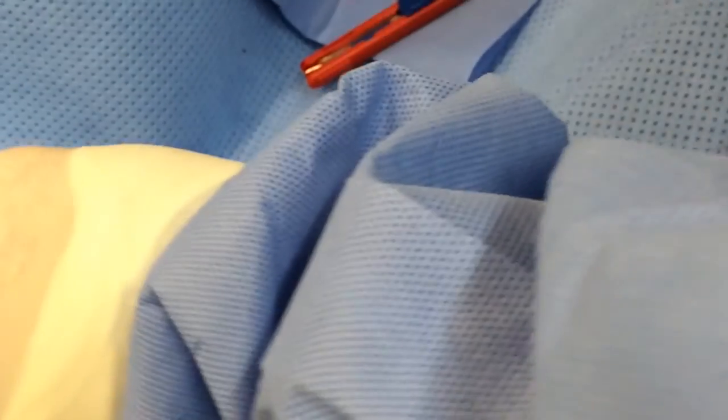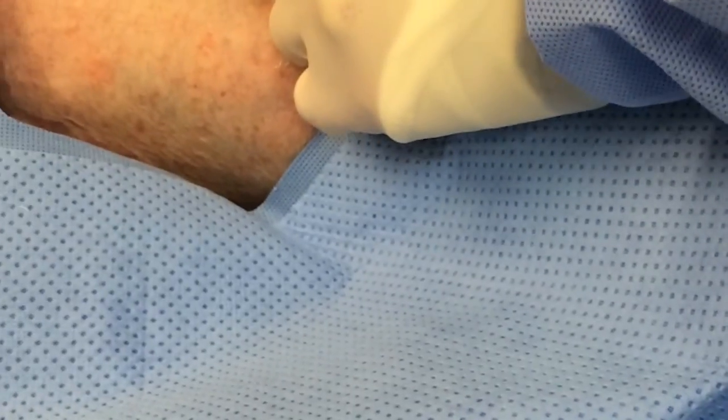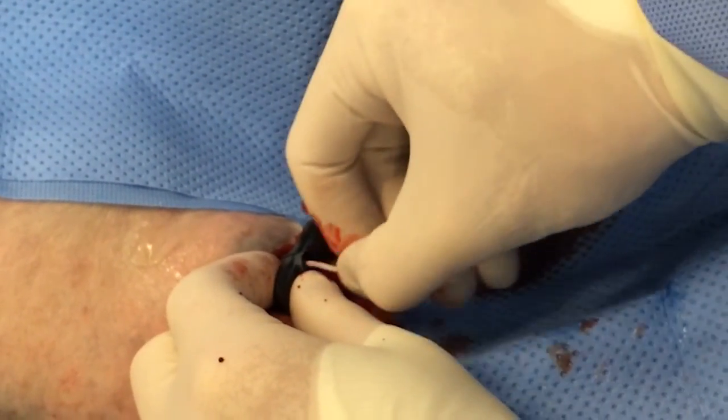He's removing the interstylet. You saw that rush of blood. He puts his thumb over it to prevent the patient from exsanguinating. And now he's going to take the pre-stiffened midline. I'll explain what all that means. He's going to gently insert it into the breakaway dilator. He's going to advance it up.